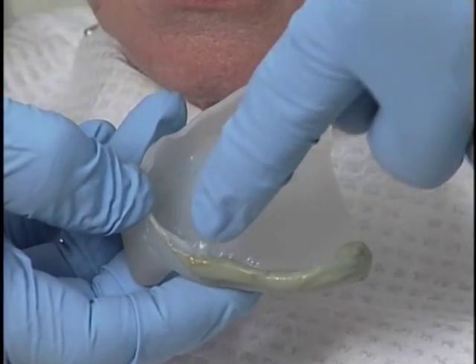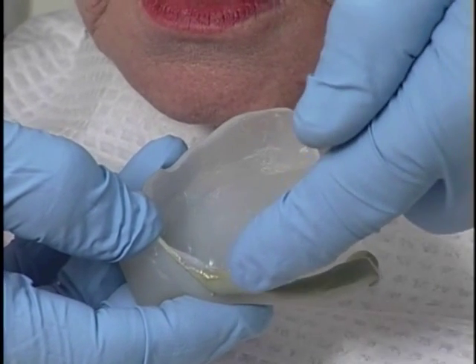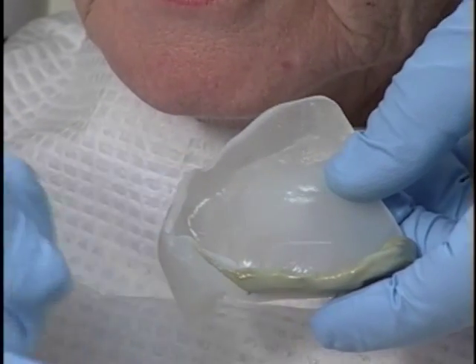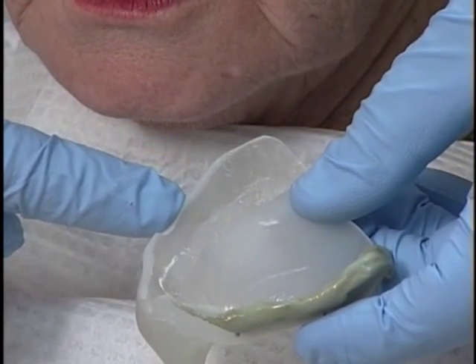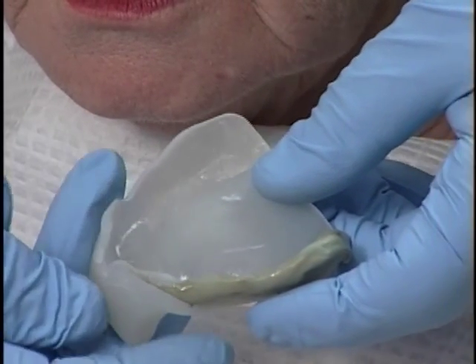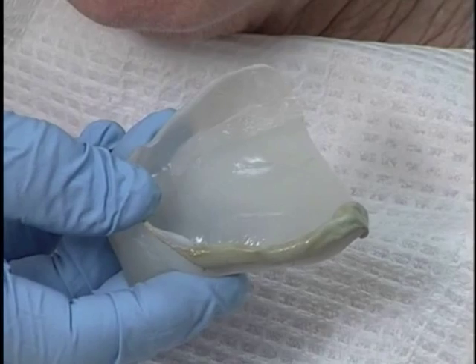We can see that we got a good border molding of this left area of the tuberosity area, zygomatic arch, and the buccal frenum. Now, this tray will actually take 4 applications of compound to totally border mold it. The second application will be a similar one on the patient's right side. The third application will be across the labial, and the last application will be across the posterior palatal seal area from hamular notch to hamular notch.